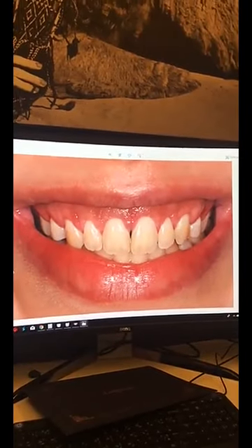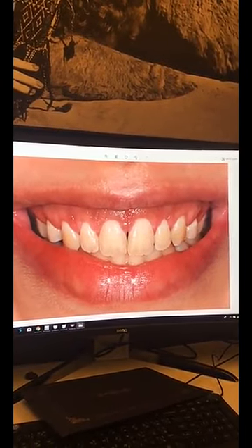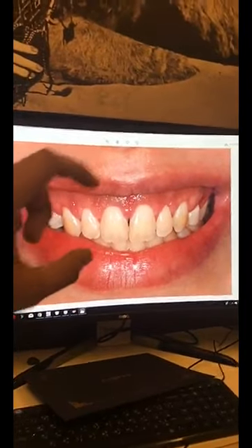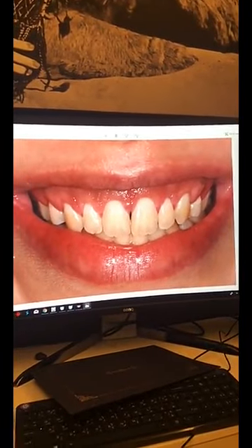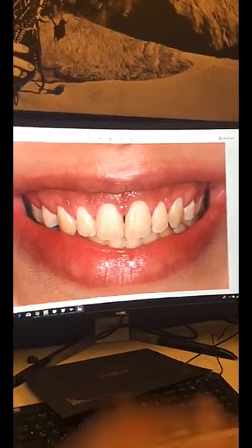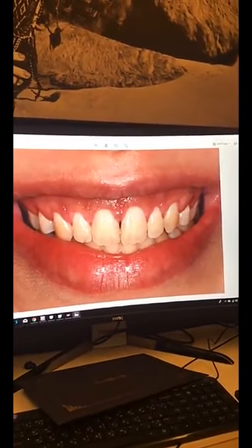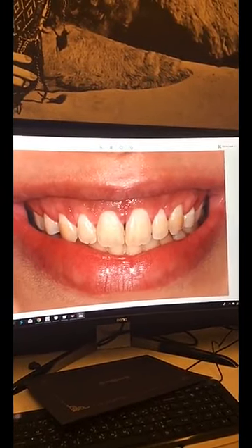We can see the final results here, how the patient looks after a certain amount of healing has been completed. We can see that proper clinical crown height has been exposed, and hopefully after the complete soft tissue maturation and healing, we will get a proper gingival contour with proper aesthetic results, pleasing for both the patient and the performing surgeon.